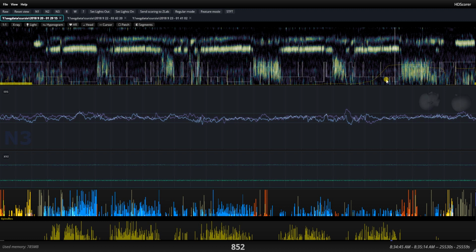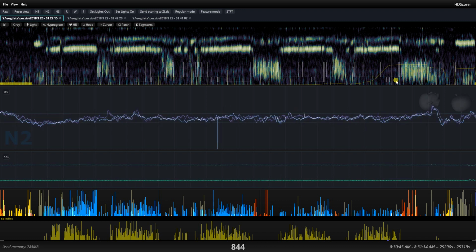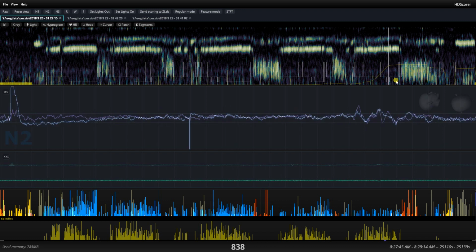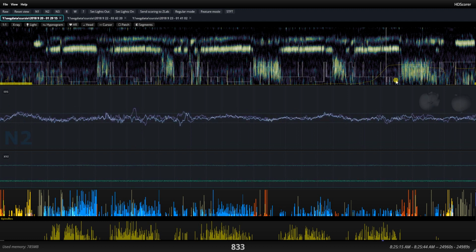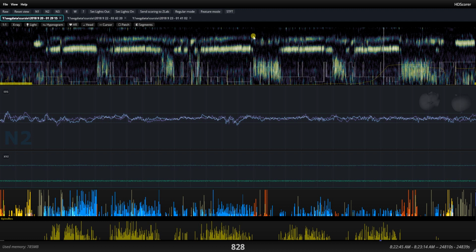Now, this is a place where, in spite of the smoothing, it's still kind of going back and forth. So this tells you that this is really somewhat in between N2 and N3, which is exactly what I see visually. Whereas here it's absolutely N2. All right, I think I've done enough validation on this recording of the N2 versus N3.